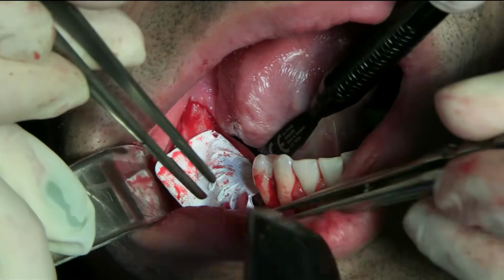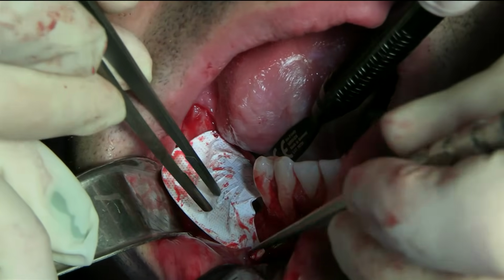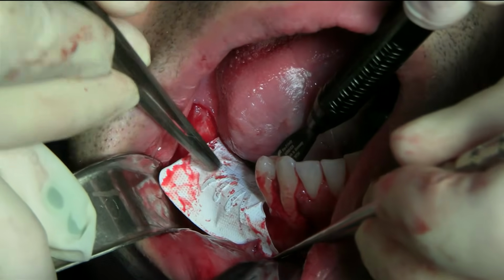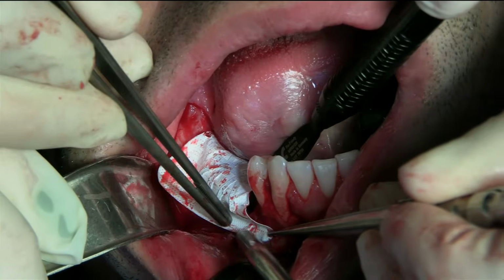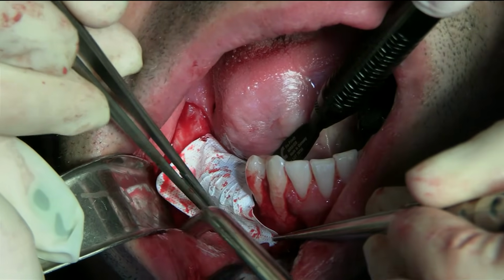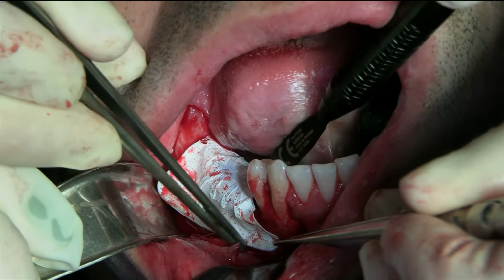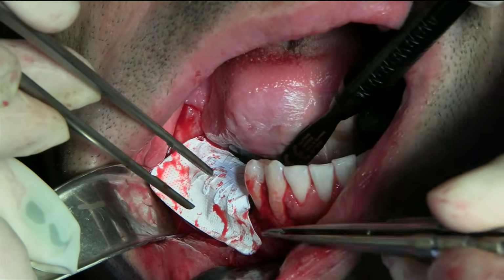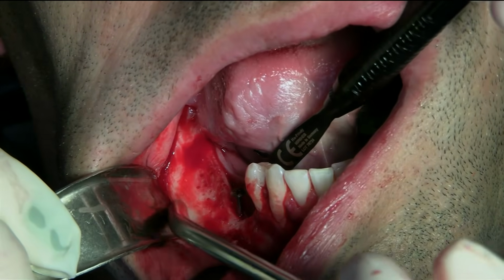You got to get with this one under the flap. Okay. Where's the mental foramen? Okay, so I can see the mental foramen is right here. So I got to cut here like a semi-lunar.